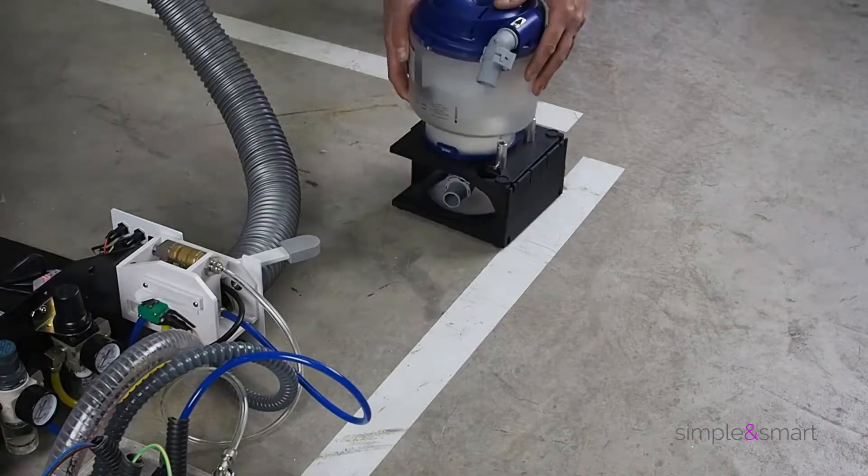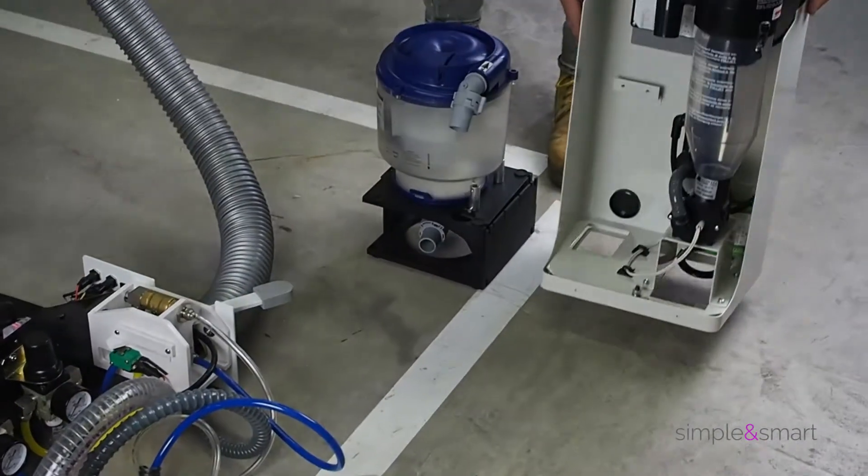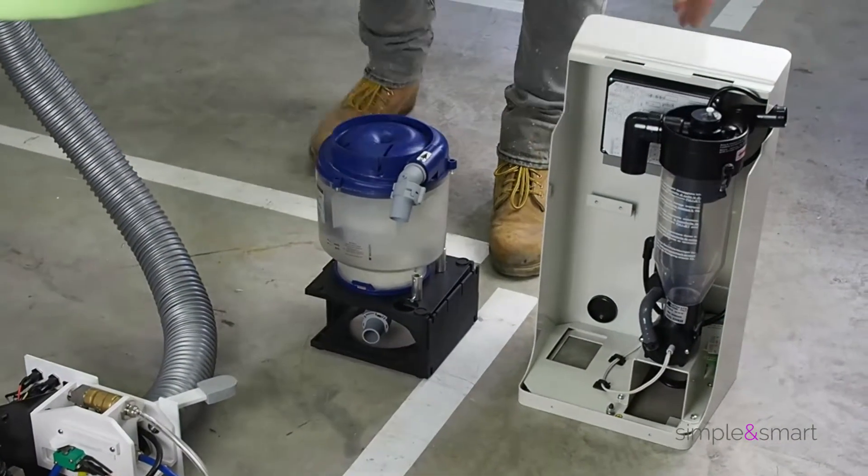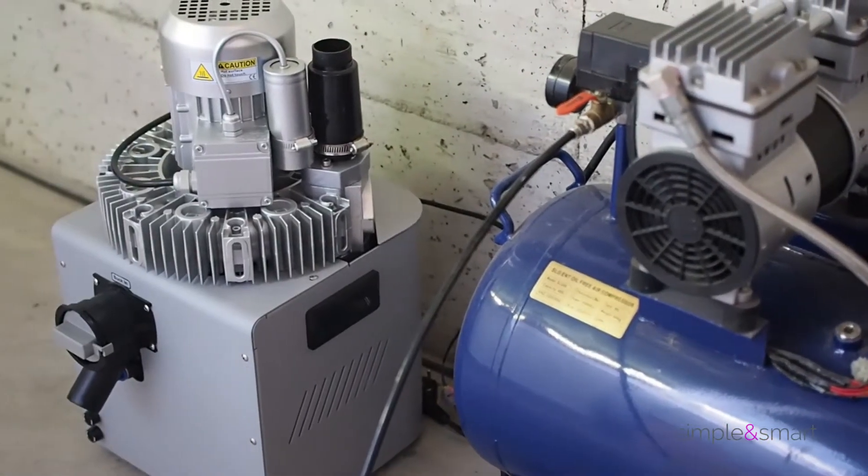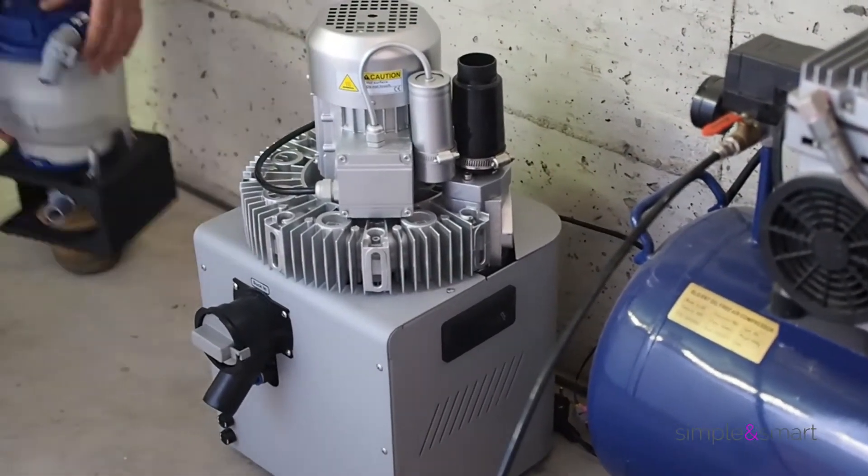In case you need an amalgam separator or an air separator for a dry suction system, we suggest to keep these next to the unit or even better in the machinery room. In this way, you have less in the operating room and you will simplify the cleaning process.